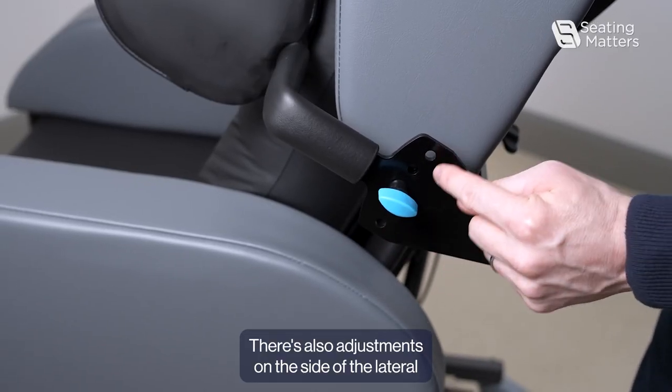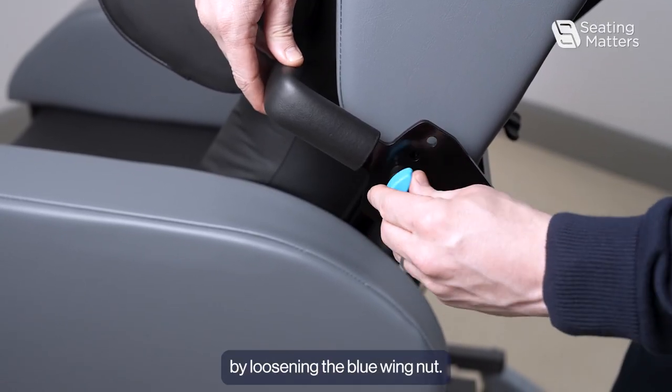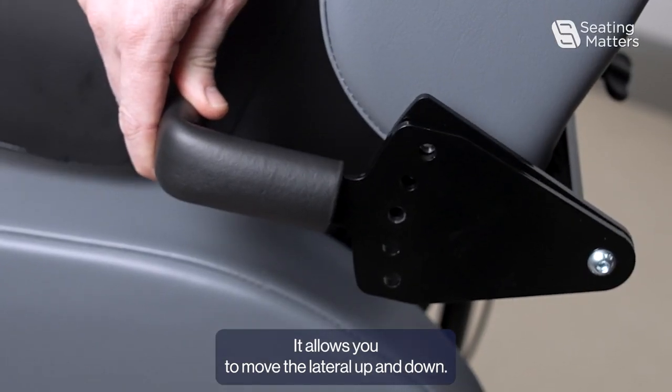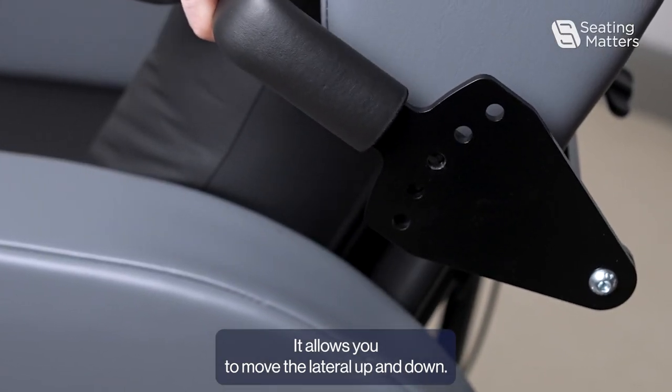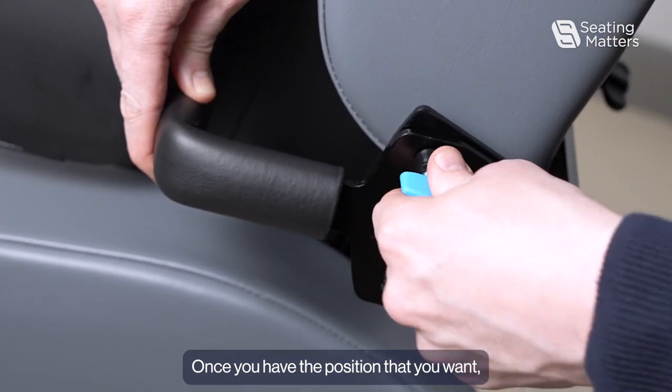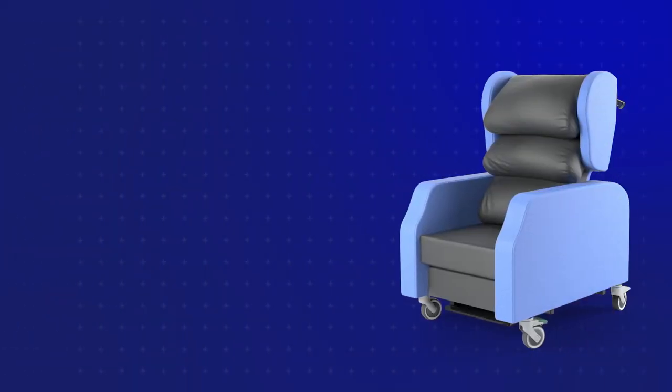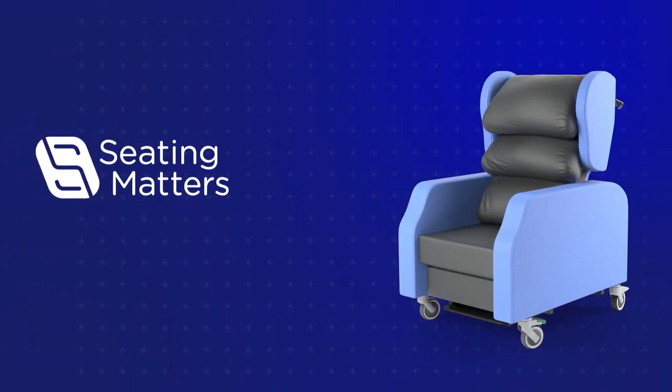There are also adjustments on the side of the lateral. By loosening the blue wingnut, it allows you to move the lateral up and down. Once you have the position that you want, you can then lock that in place as well.